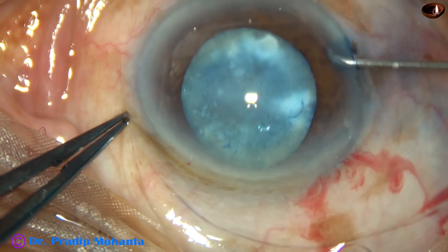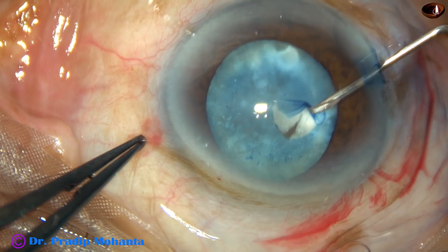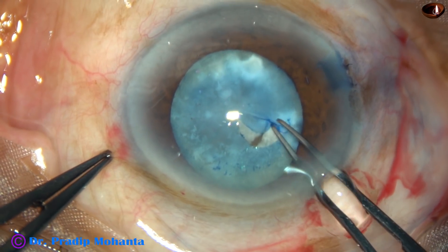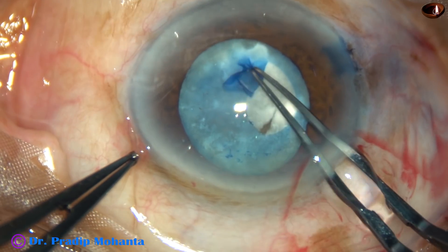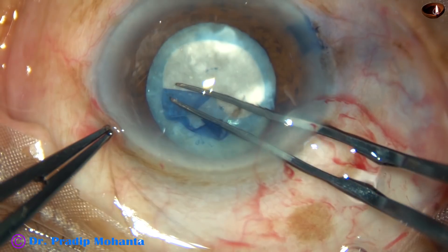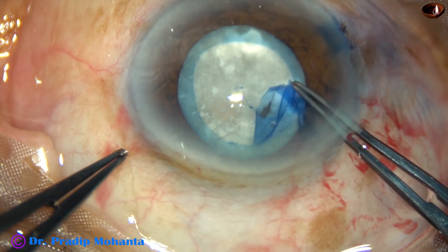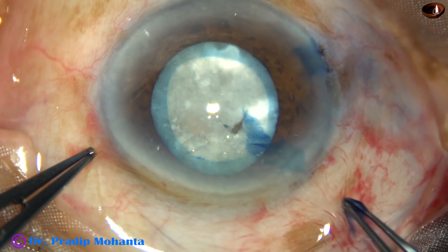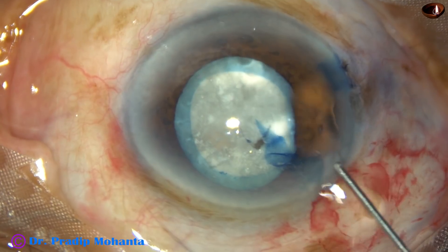By this time I have stained the capsule and now I am going to do capsulorhexis. I am very careful because the zonules may be very weak in such cases, and I may have to apply a capsular tension ring. So I am making a capsulorhexis which is not very large — about 5 mm in size. I have gone very slowly and very gently for only one reason: I shouldn't exert any jerky pull.